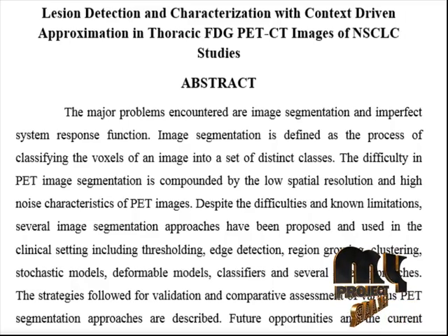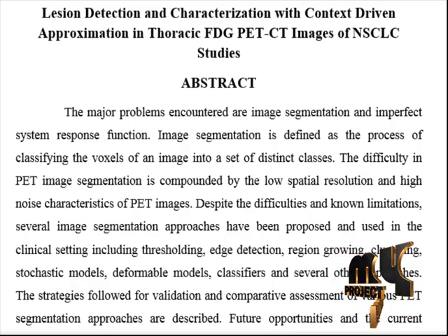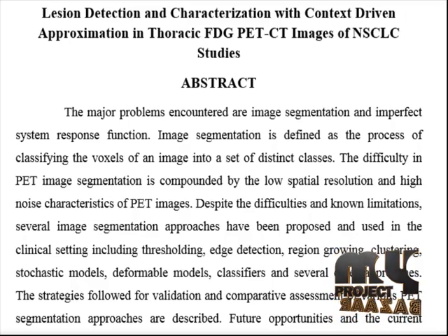Small lesions are only 2 or 3 voxels in diameter and of marginal contrast. They could easily be missed by human observers. Our method aims to provide radiologists with a map of potential lesions for decisions so that the diagnostic efficiency can be improved. It utilizes both PET and CT images. The CT image provides a lung mask to which lesion detection is confined, whereas the PET image provides the distribution of glucose metabolism according to which lung lesions are detected.